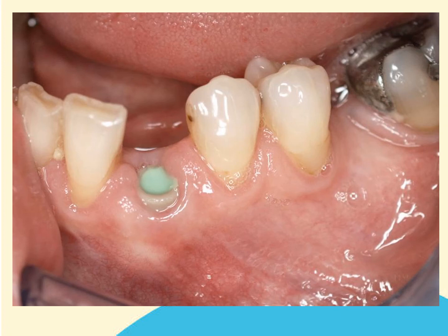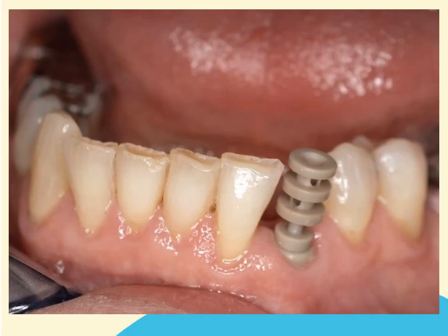This clinical picture shows a base in situ on top of an implant in a patient's mouth. For hygiene reasons, it's been covered with putty. The putty has been removed and the clicking top pushed into the base so it fits securely. You will not necessarily hear an audible click when the two components go together, but the component should be quite firmly attached with minimal or no mobility.